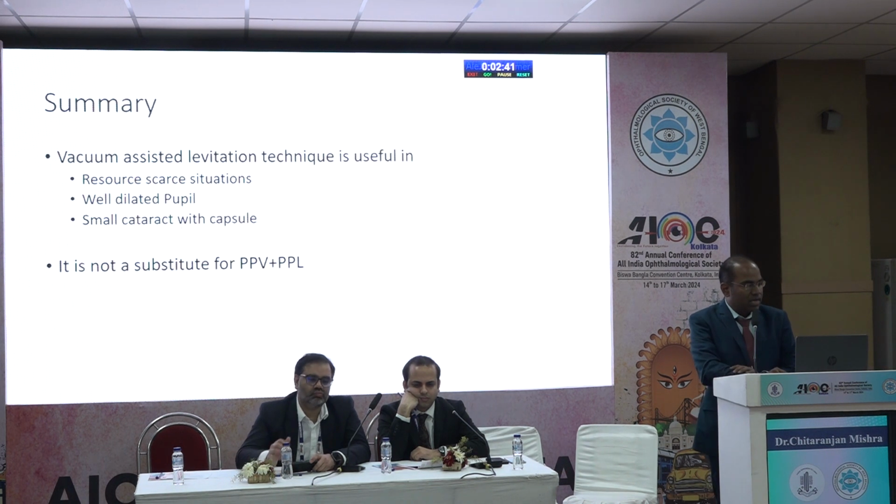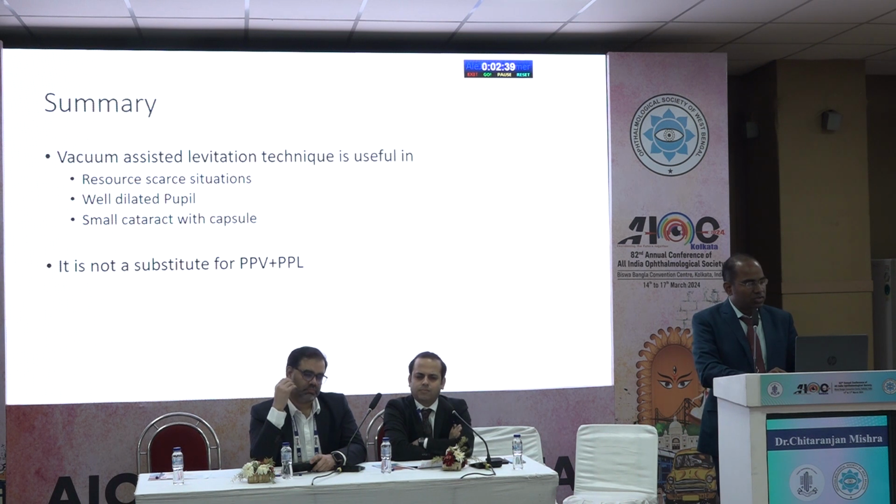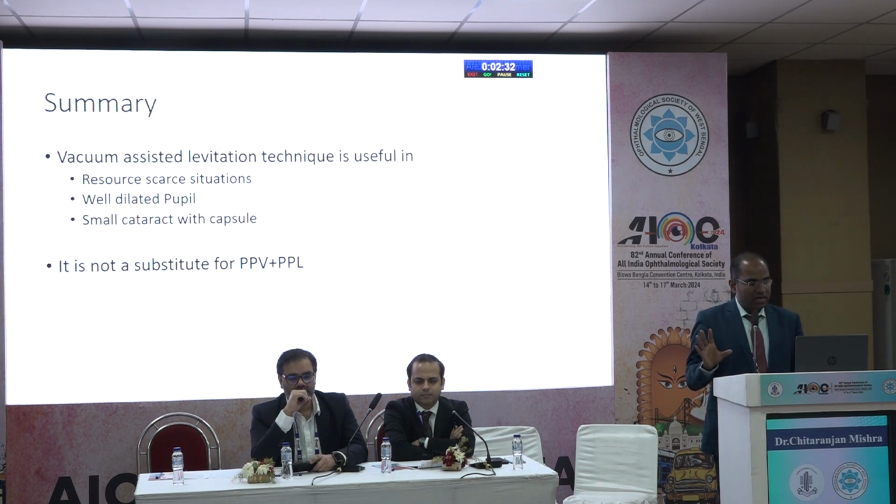To summarize, the vacuum assisted levitation technique is useful in resource scarce situations, in a well dilated pupil, and a small cataract nucleus with intact capsule is better. However, without an intact capsule also we can do this.